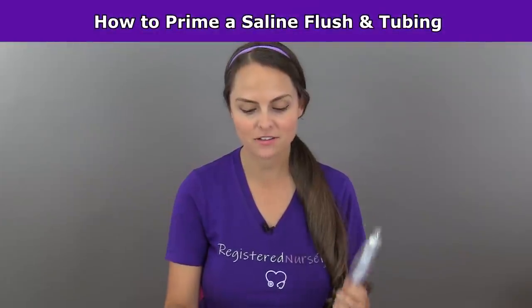Hey everyone, it's Sarah with RegisteredNurseRN.com and in this video I'm going to show how to prime a saline flush and how to prime your extension set whenever you're starting a peripheral IV.